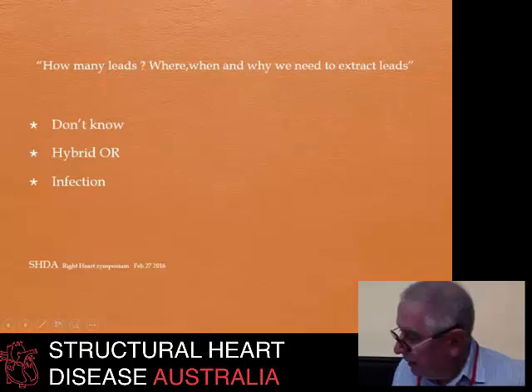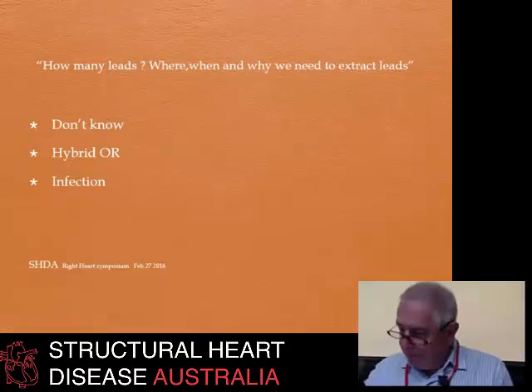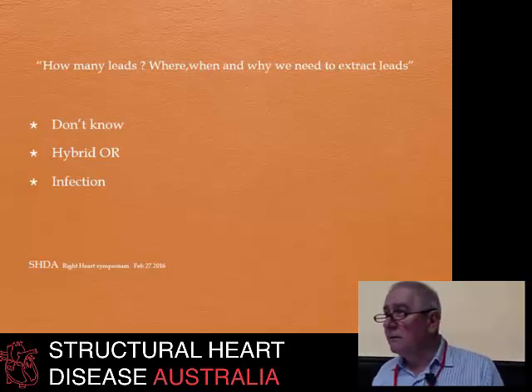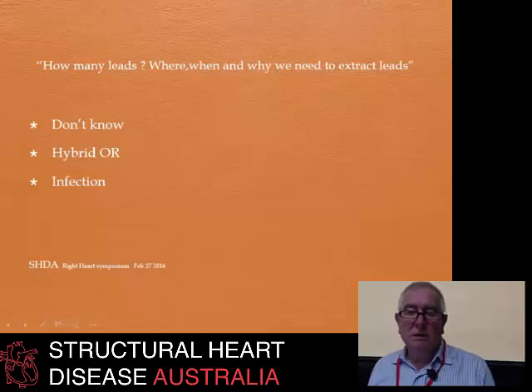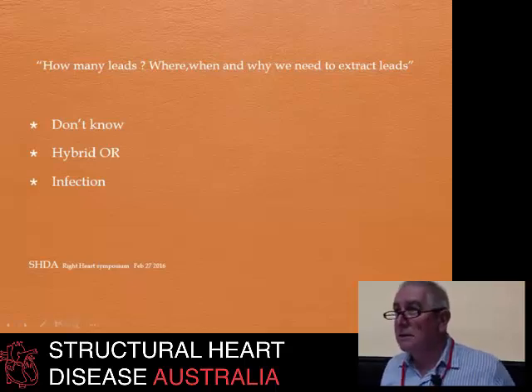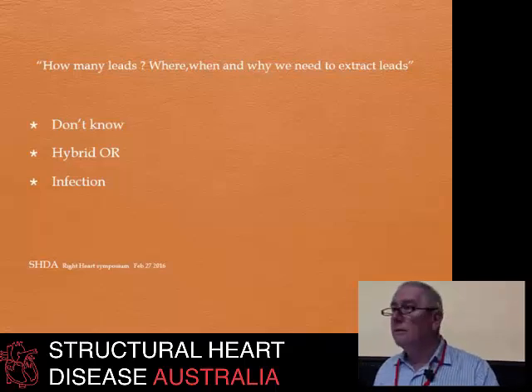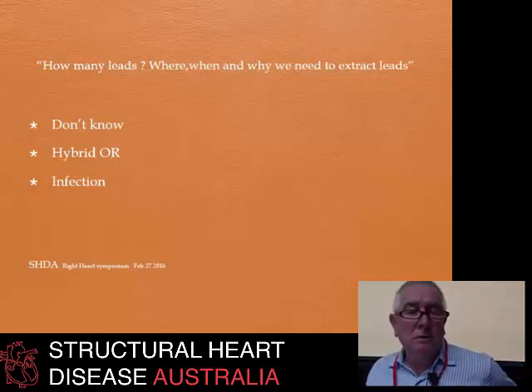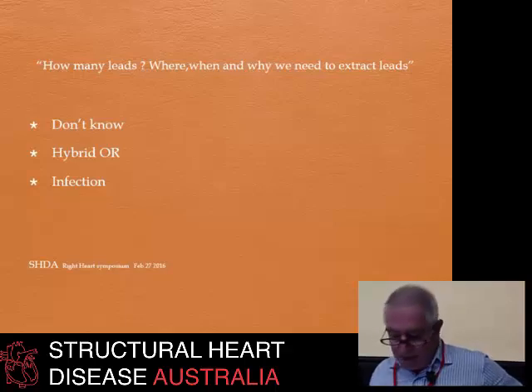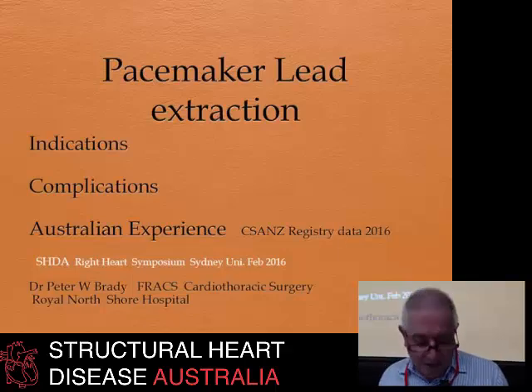Okay, thank you. So when I was first asked to give this talk, I was asked to talk about basically lead extraction, and then the final topic that came out was how many leads, when, where and why we need to extract leads. Given that this is late Saturday afternoon and some of you have got a life, I thought I'd do a short version, which is how many leads, I don't know, where should it be done, in hybrid OR, and why do we need to take them out, and basically infection is the answer. So if that's all you need, you can go now.